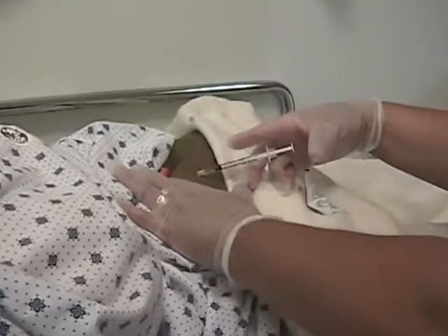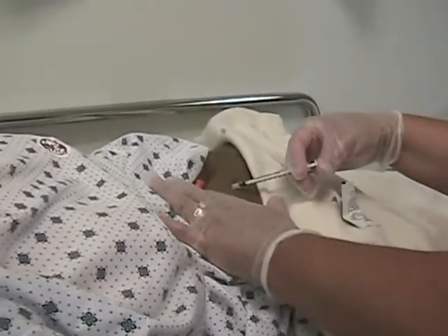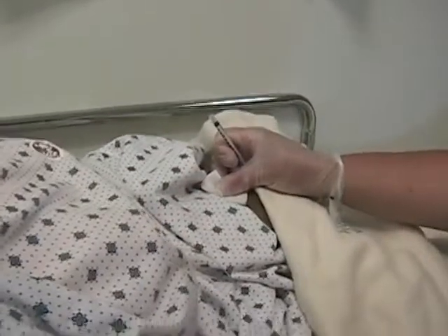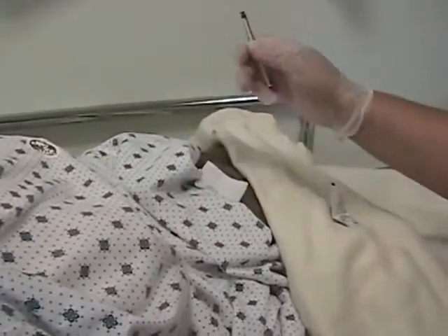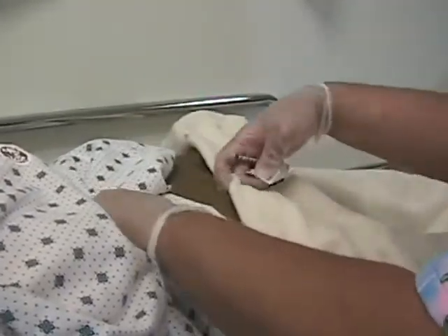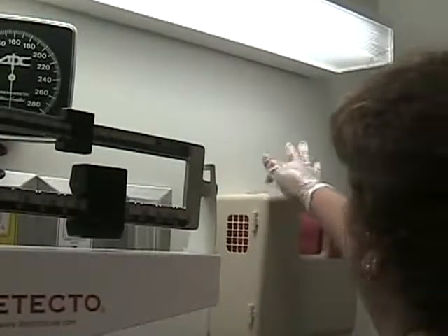Bevel up, inject. Go ahead and put in the 10 units, pull out, grab my gauze, hold, do not massage. Do not recap your needle at this point. Go ahead and hold. Cover your patient. Do not leave her. Go ahead and put your needle and syringe in the sharps container. Again, folding your garbage in your gloves.